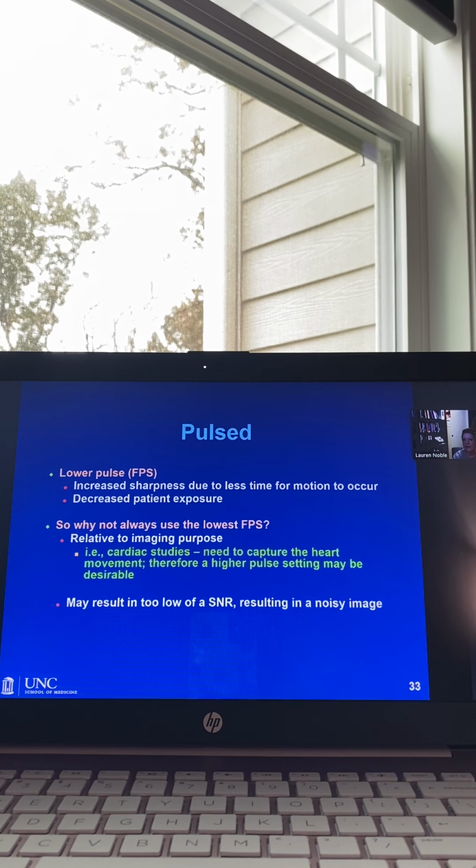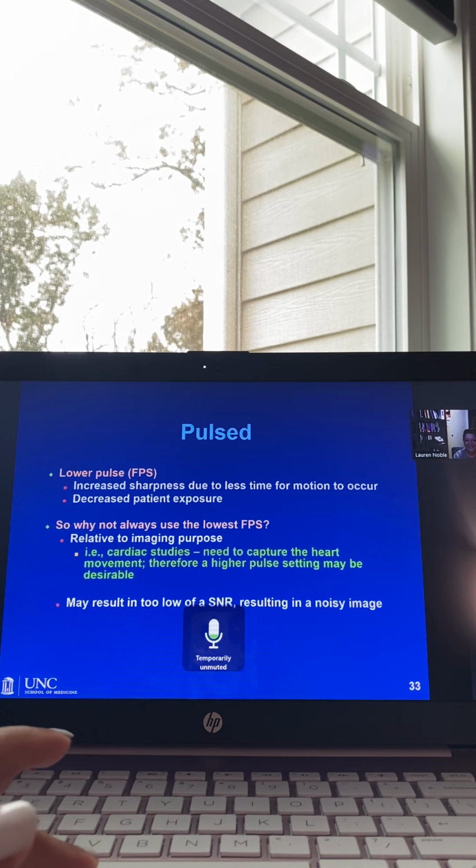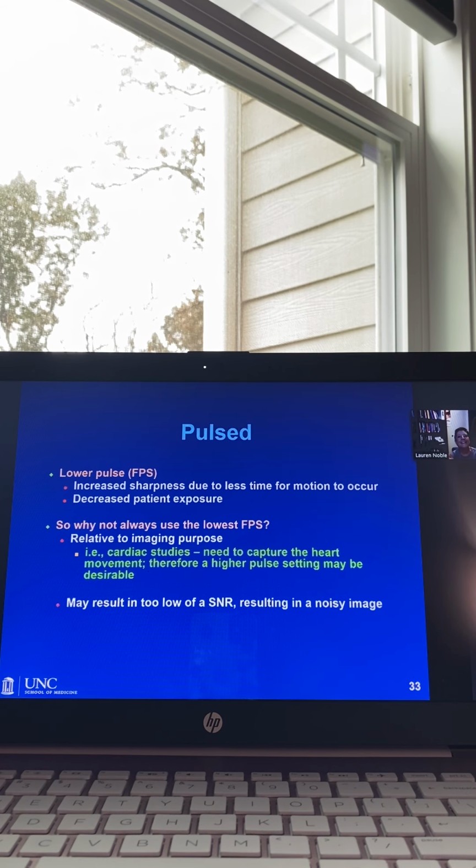Did they finally get it to work? Yeah. After a while, they called someone in, and then the guy was just like, "You have to take the pulse off," and they were like, "Oh." So yeah. Typically you do, but like I said, I don't want to say 100% just in case there's something new out there, but typically, yes, you have to disengage it from that pulsed function in order to use a different function. Yep.